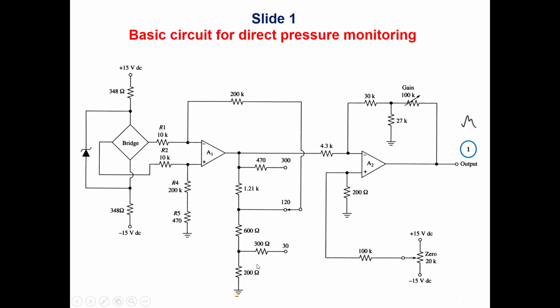So we have a first differential amplifier and we have a second differential amplifier. However, the difference is, in the first one, we only use this differential amplifier to make amplification, whereas in the second differential amplifier, we have two functions. The first function is zeroing, and the second function is a calibration of the machine from time to time due to the aging of the different components in this circuit. Okay, this is done usually during the preventive maintenance.